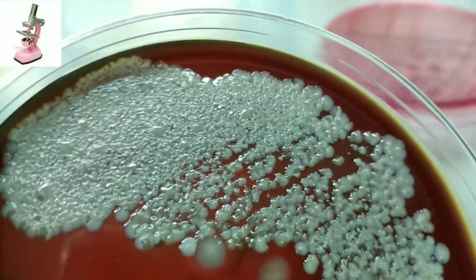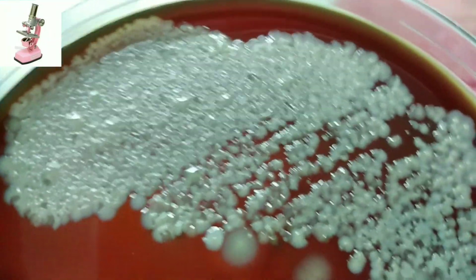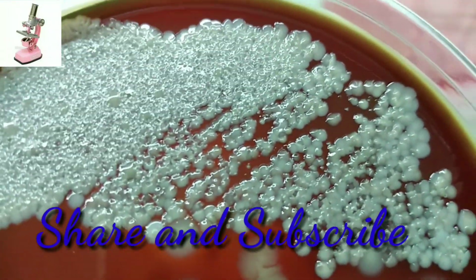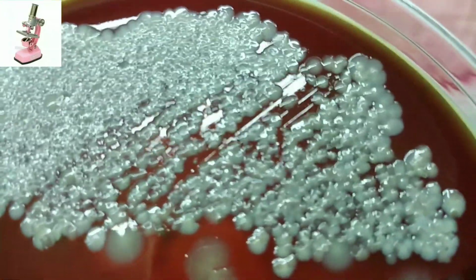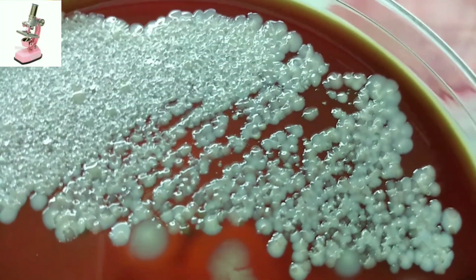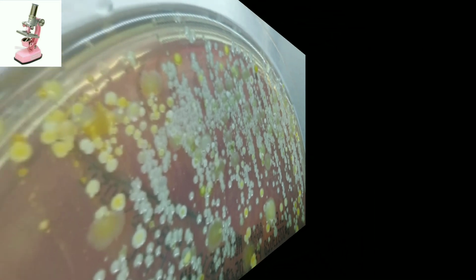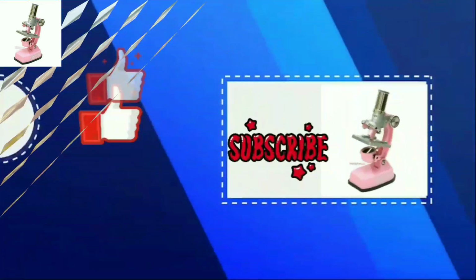sample. So collection is a very important part, and collecting clinical history, antibiotic history, and informing patient how to collect, and collection in a sterile container is also very important. It's very important because urine sample is very important for culture to identification of urinary tract infection. See here, lots of mixed colonies. So it's clearly showing the sample is improperly collected.